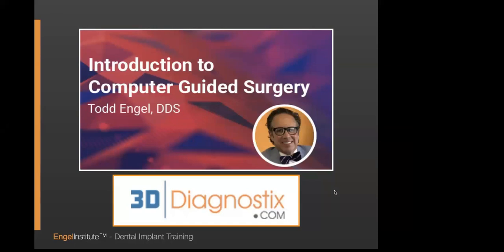We have organized a series of educational webinars to learn more about all the steps of computer-guided surgery and how we can make our guided implant surgery and implant practice a less stressful and a more efficient and a more successful one. Please check our website, 3ddx.com, for more information about our webinars.